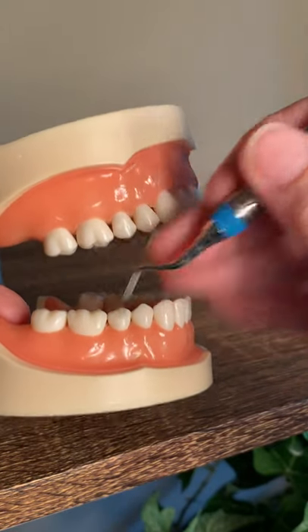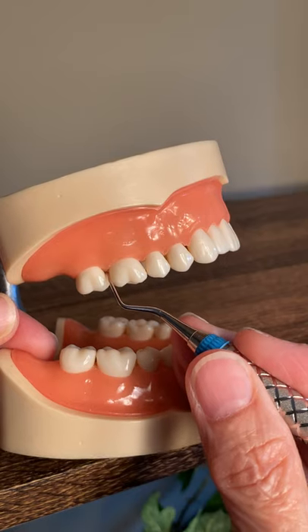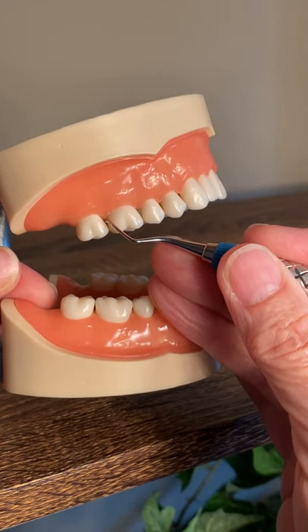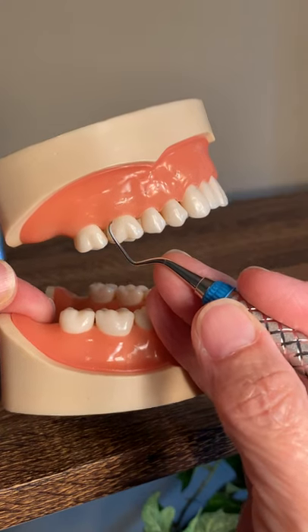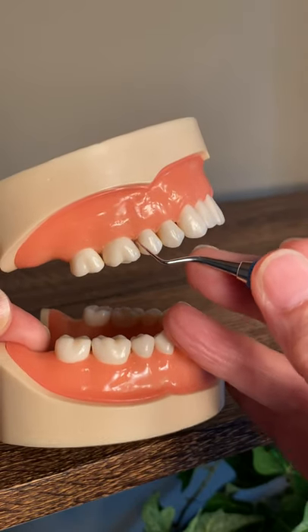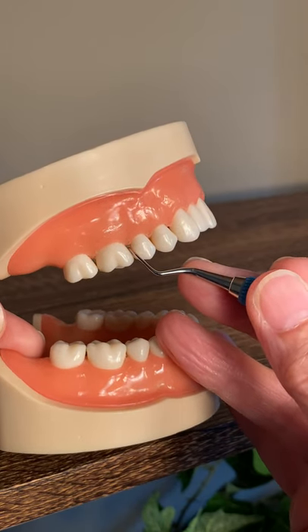If I go to the maxillary, I would flip the end and again place it so the shank is parallel to the long axis with the handle coming out of the mouth. I can do the distal of number three, come across and do the facial, and do the mesial — so the mesial of three and the distal of four without having to switch. If I was using Gracies, I'd have to switch from the 11-12 to the 13-14, so this is really nice.